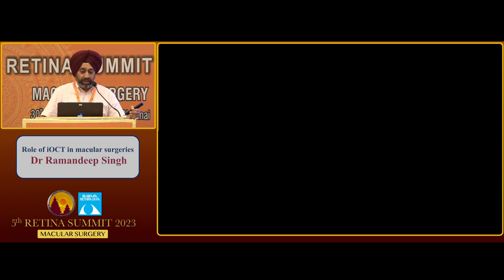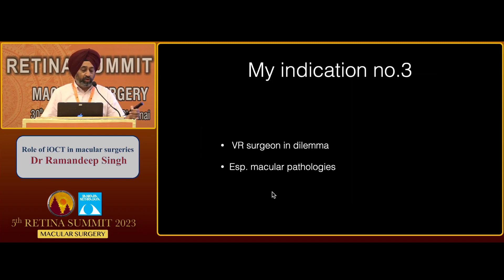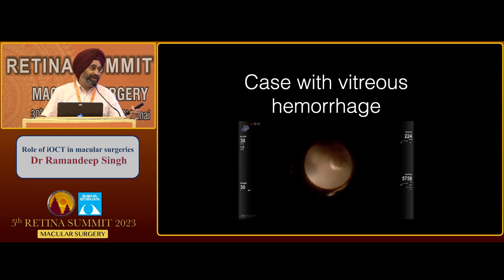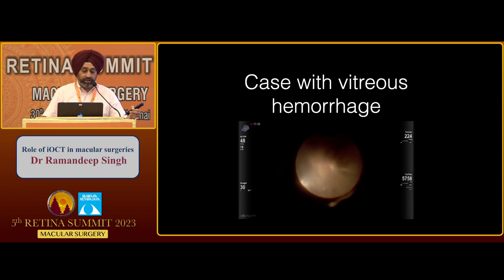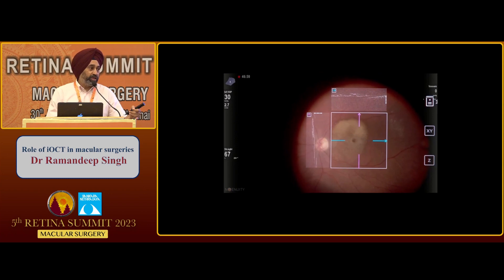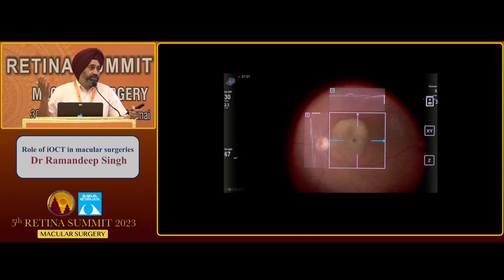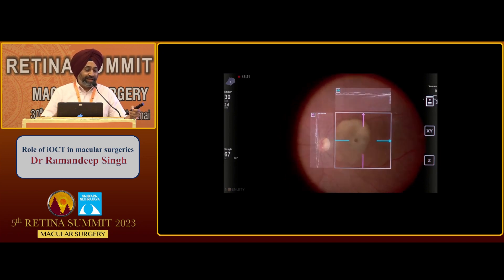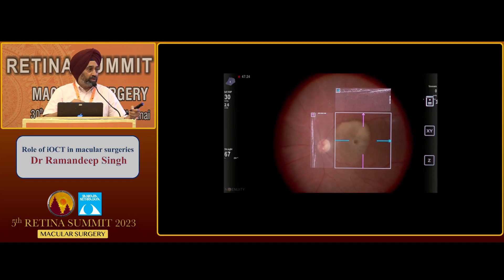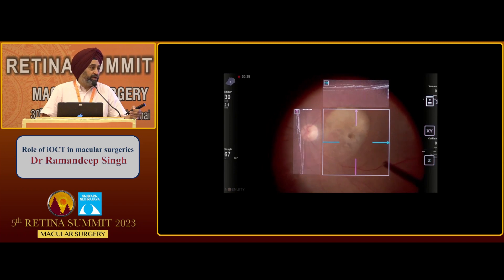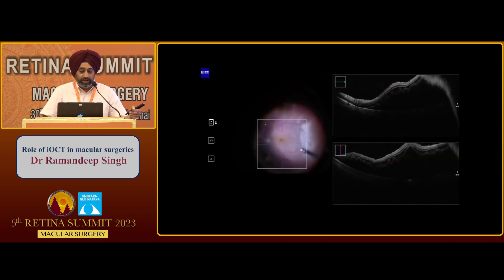This is a case where we injected TPA. A fellow in my OT can use these tools whenever in a dilemma. My fellow was operating late at night on a case with gray vitreous hemorrhage. At my experience level someone might say it's Terson syndrome, but she smartly ran an OCT and saw that the lesion was superficial to the macular layers. She could easily go ahead and peel the membrane rather than calling me at night to ask what to do next.